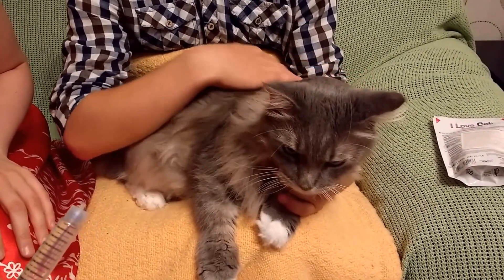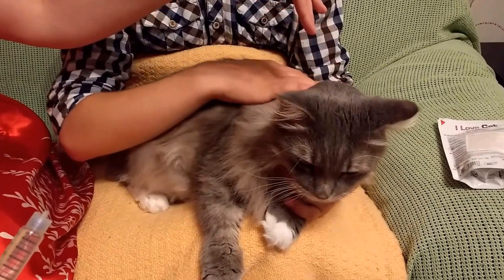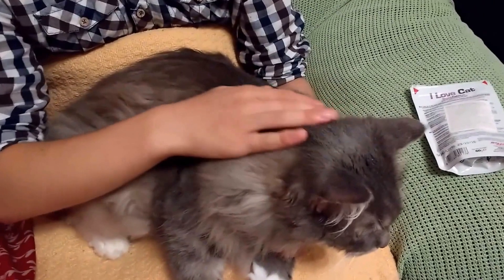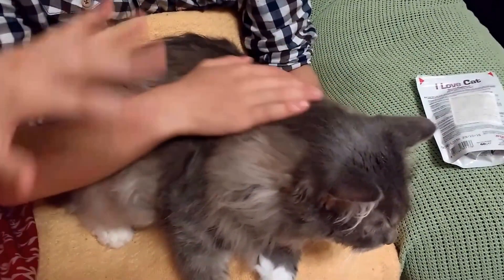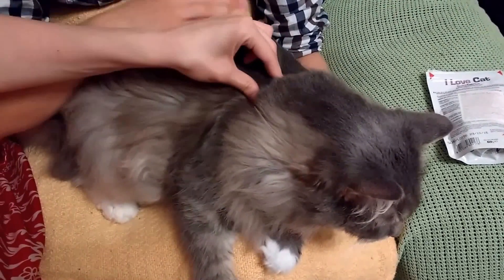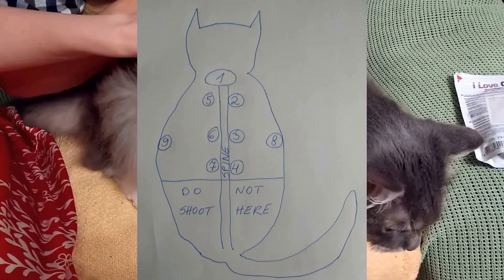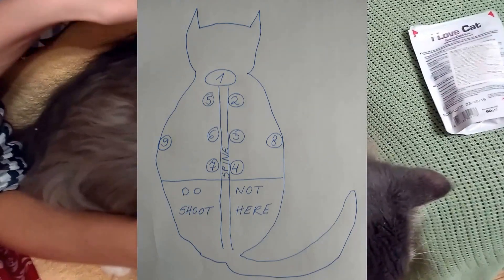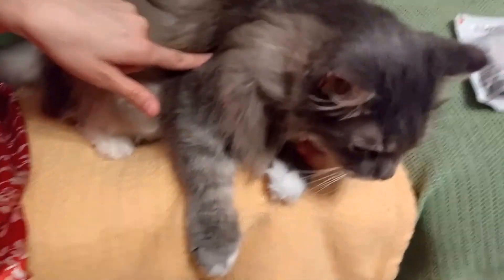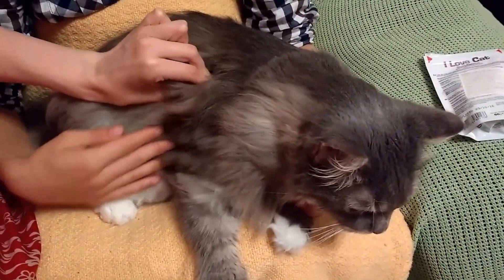You have different places where you can inject the cat. You can use the back of the neck. Don't inject on the spine, but use both sides of the spine. You can use the shoulder blades, the middle back, and the lower back on both sides. You can also inject on the sides.